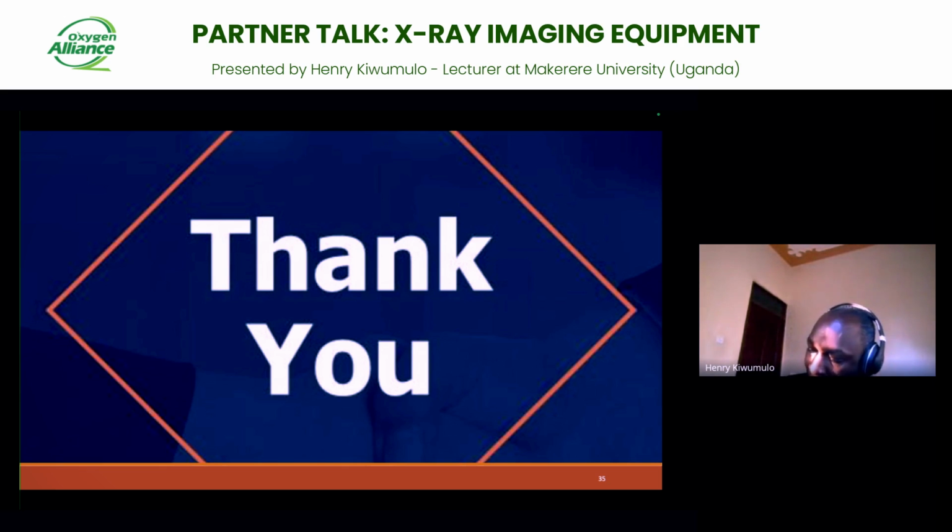So Dr. Robert, of course, asked, where do I start? That's quite a powerful question. But of course, when we talked about the first slide, the planning, I think, is one of the key aspects that one should always start with. And the planning, of course, involves quite a lot. But I would think that, first of all, one has to bear in mind the type of population of the X-ray patients that he or she hopes to take. Because you may find that this population can always dictate the type of machine that you'll acquire.